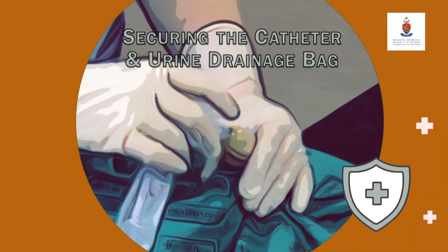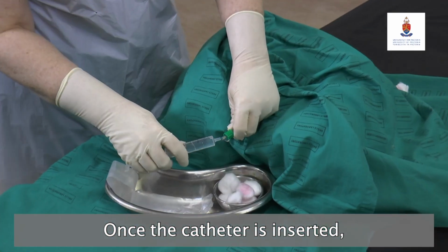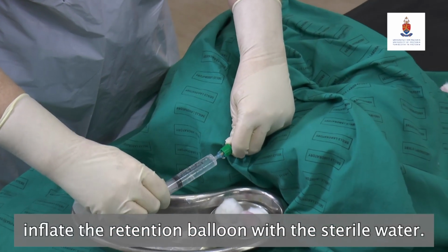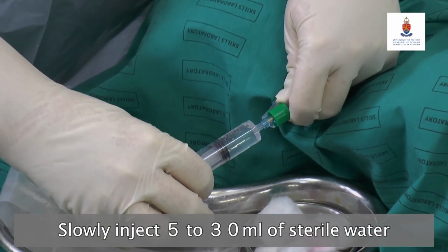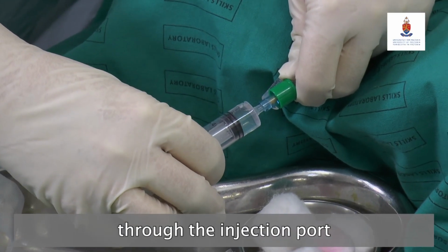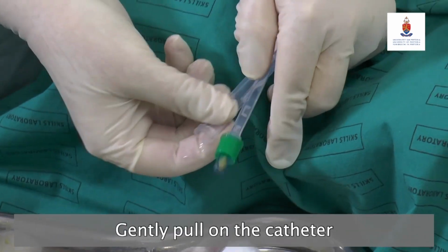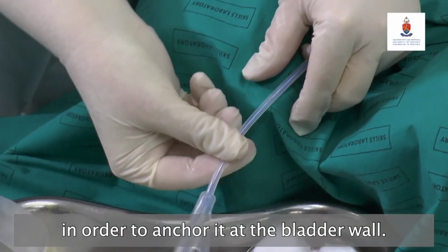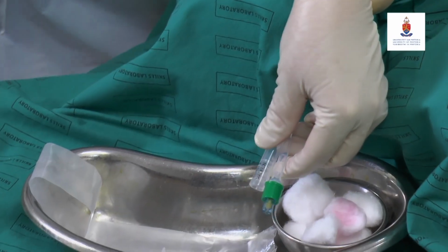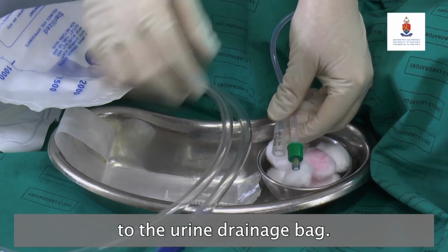Securing the catheter and the urine drainage bag. Once the catheter is inserted, inflate the retention balloon with the sterile water. Slowly inject 5 to 30 milliliters of sterile water through the injection port while still holding the catheter in place. Gently pull on the catheter in order to anchor it at the bladder wall. Attach the distal end of the catheter to the urine drainage bag.